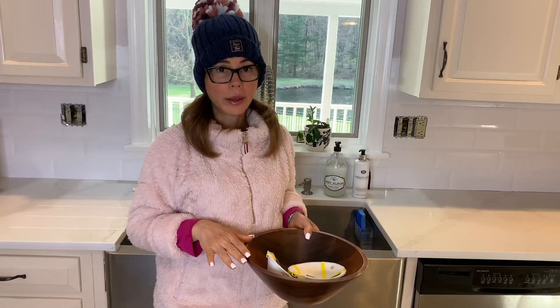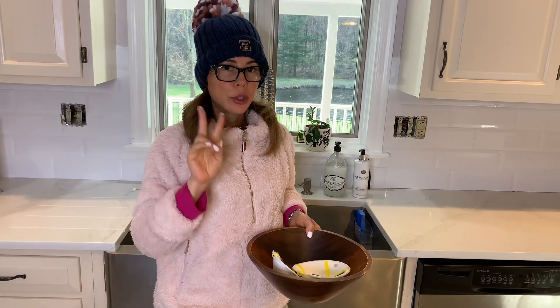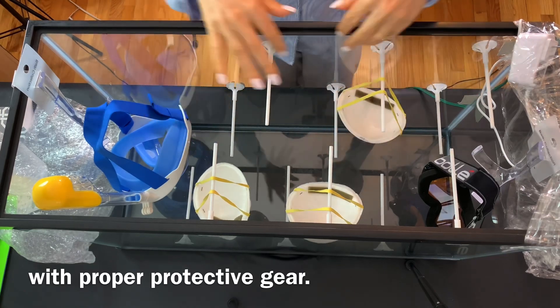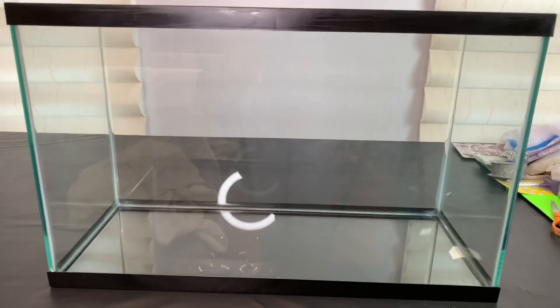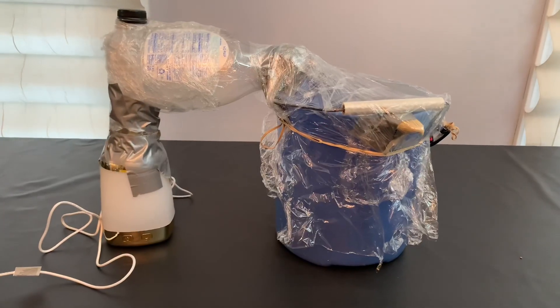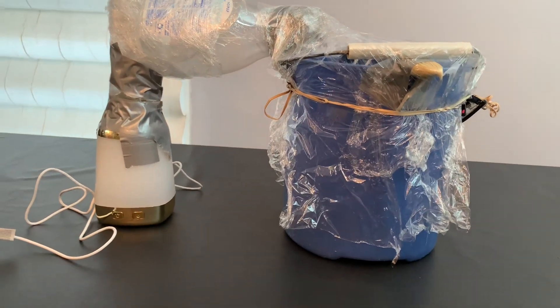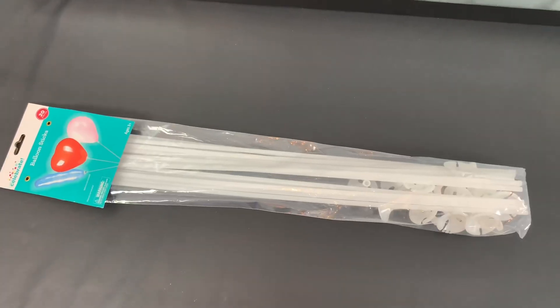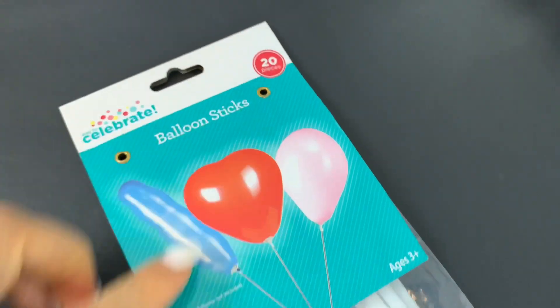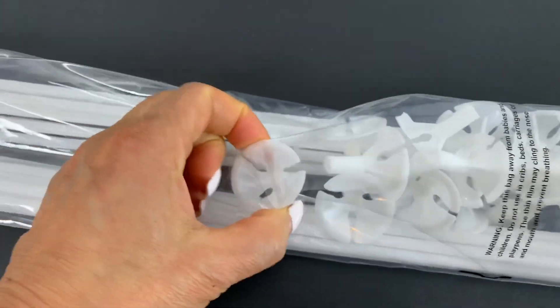Now step number two is getting the masks that need to be decontaminated inside of the mask decontaminator. To build the decontaminator, you're going to need a container big enough to fit all the items. In my case I am using a fish tank. You can also check my other video on how to make a smaller one using homemade items. We are also going to need balloon sticks — a package of 20, very long, with a little base to hold the sticks.